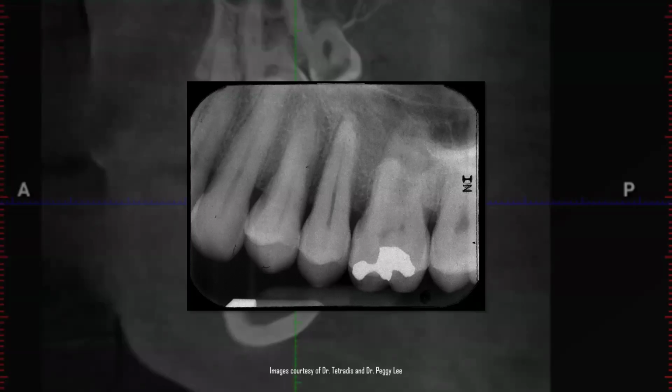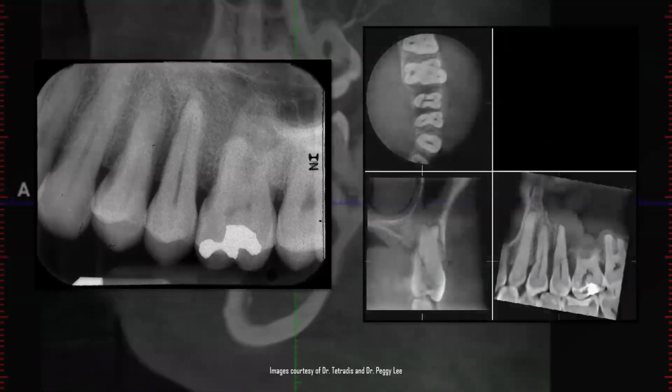And as I talk about indications, that's one of the indications for CBCT. Most of the guidelines say you don't use it by default, just like for any radiographic prescription. But when the symptoms don't match what you expect to see in your radiographs, and you think there's a good chance that you'll see more that helps you diagnose with 3D imaging. And so that was the case here. What they're seeing here didn't really match the patient's symptoms. I don't know if they got variable response to cold, but maybe they had a tough time vitality testing these teeth. And so they do the 3D image, and what do we see?